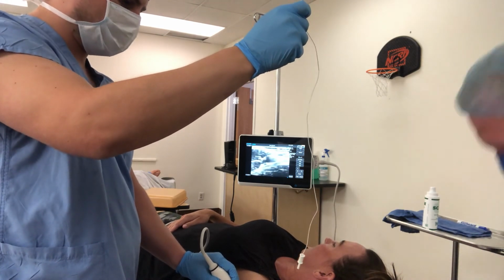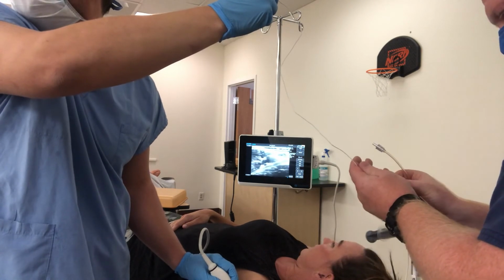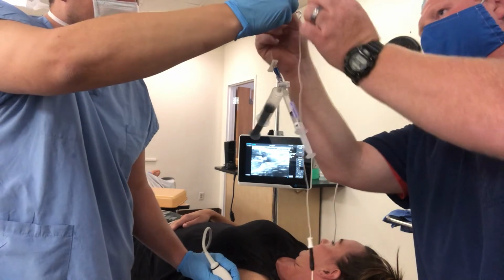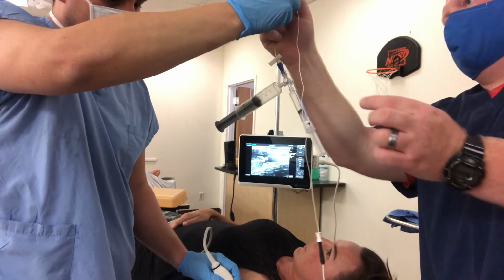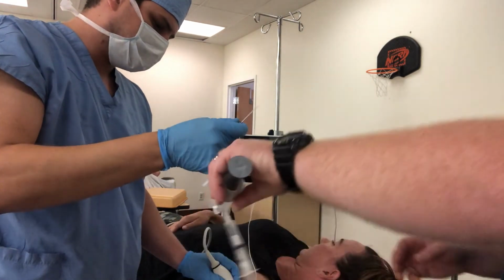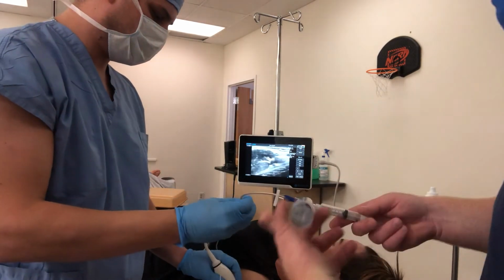For this, we will want to stimulate a thumb twitch. So we're going to place the patch on her hand, on her wrist. And if Case wants to turn on the peripheral nerve stimulator.